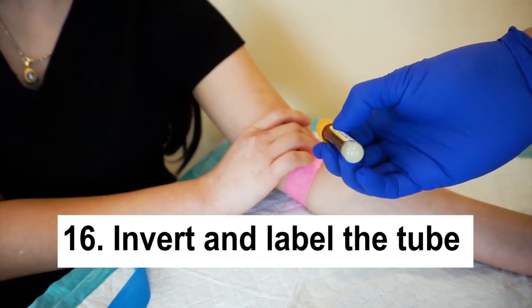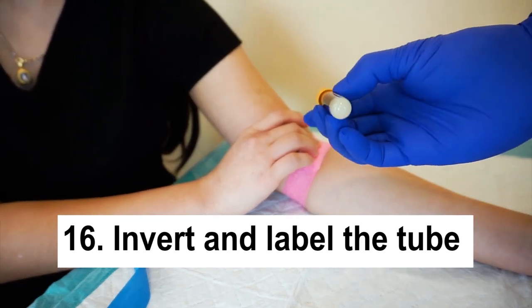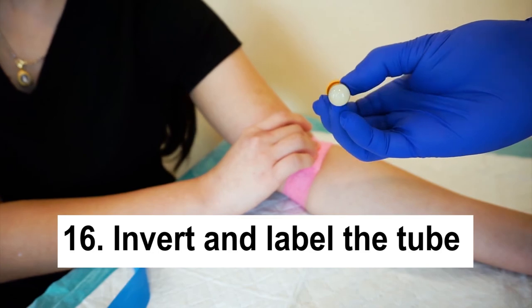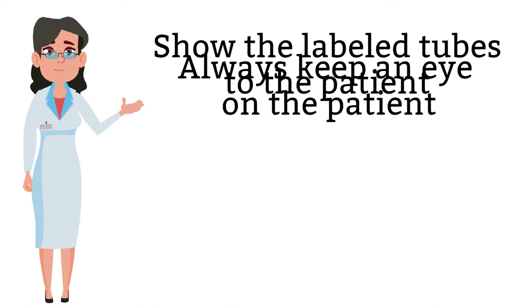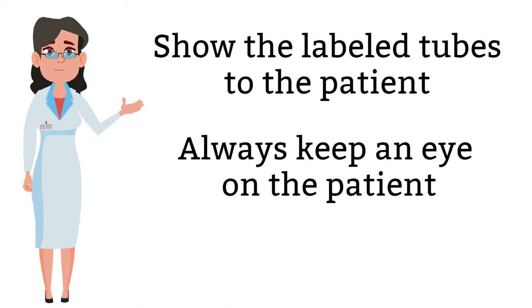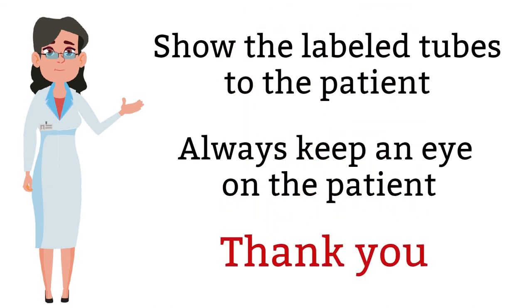Sixteen. Invert the tubes a few times and label the tubes with the patient's information. Generally, on the label, you should include your initials, date, and time of draw. As soon as you are done labeling the tubes, let the patient take a look and verify that the information is correct. While you are doing this, you will also keep an eye on the patient, making sure that the patient is doing okay and not fainting.